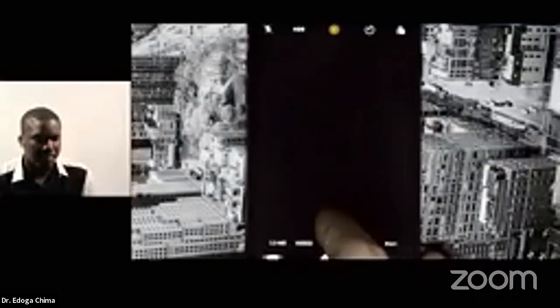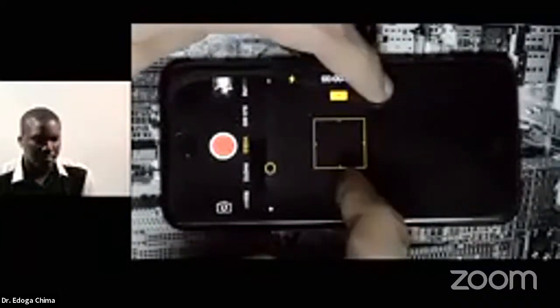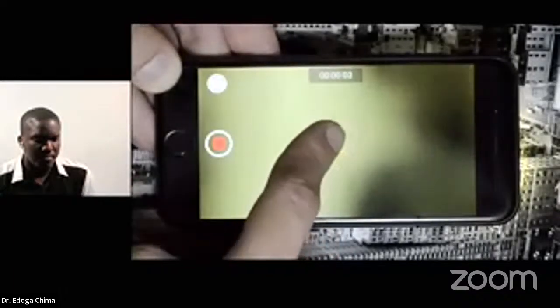This way, the flash lights continuously. Be sure the flash is turned on. Now, in the camera, pinch out with 2 fingers up to 3/4 of the zoom bar. This way, I've acquired the best results. Once you have an image of the retina on the screen, start recording. On top of the screen, just focus on exposure.